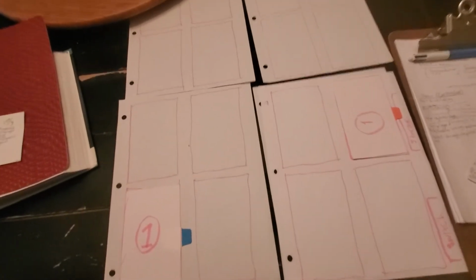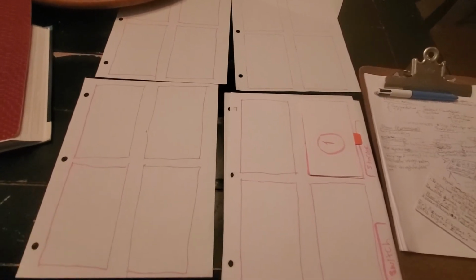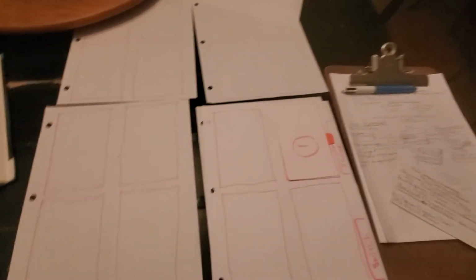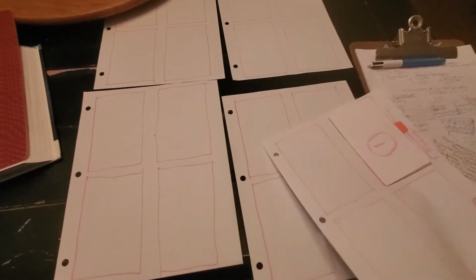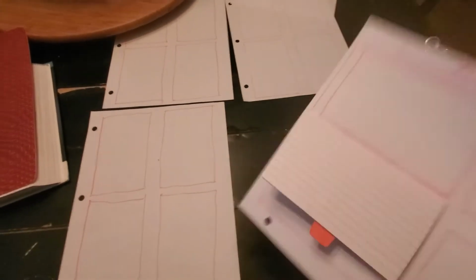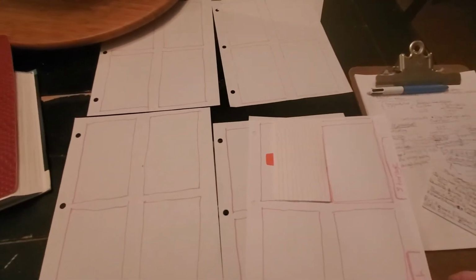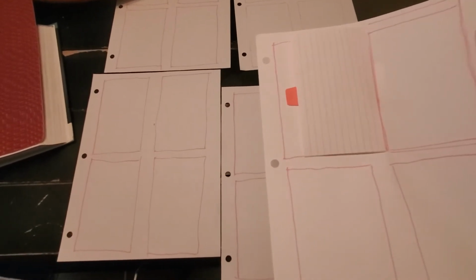The last thing that I'm going to go over is, actually, I don't know if I can do this correctly. But let's say that these were layered, such as in a CT.